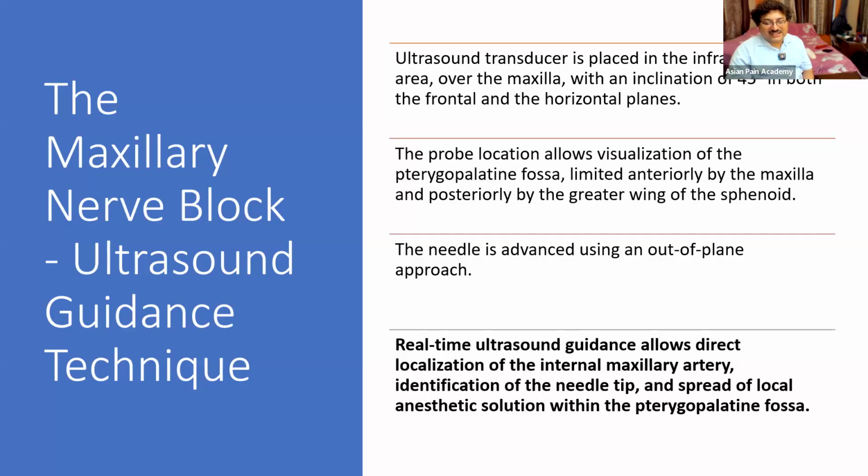And the needle is usually advanced with the out of plane approach, because at this point it is very difficult to make it in plane, and under real-time ultrasound guidance it has allowed direct localization of the internal maxillary artery, though truly speaking in my experience I am not able to see it clearly because it is so deep, and especially if the patient is thick, it is very difficult. Okay, and identification of the needle tip with the out of plane approach is sometimes very difficult, and so is the spread of the local anesthetic solution within the pterygopalatine fossa.